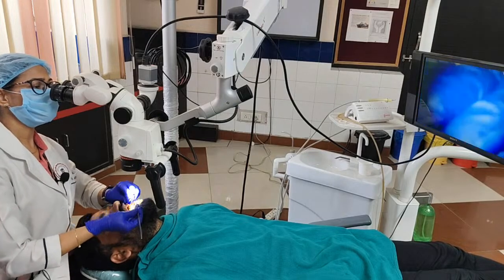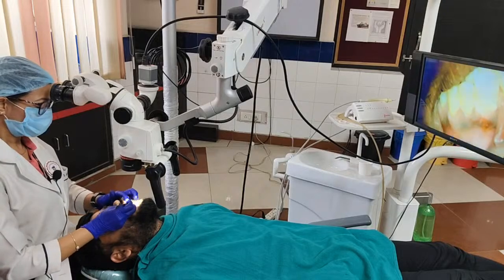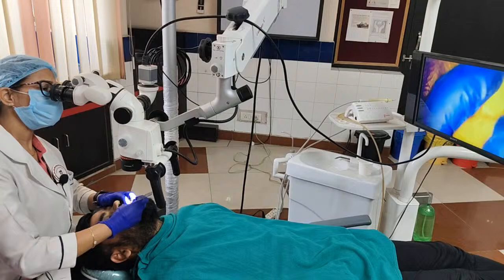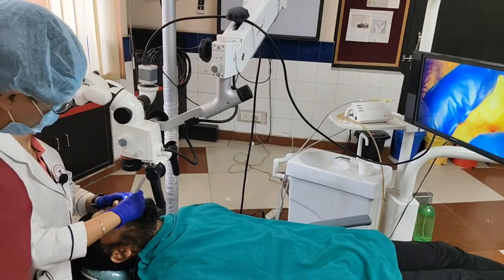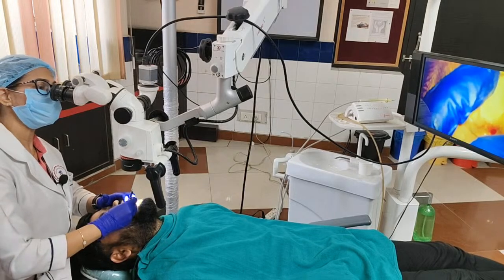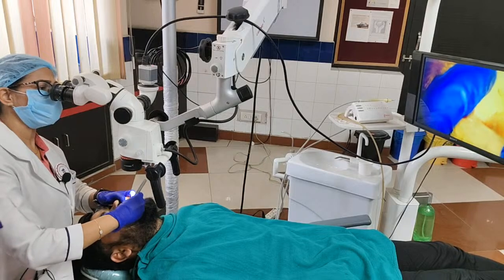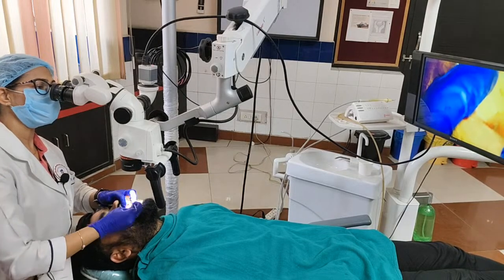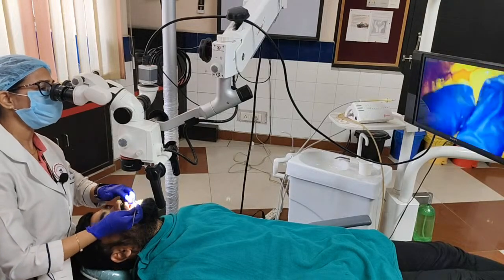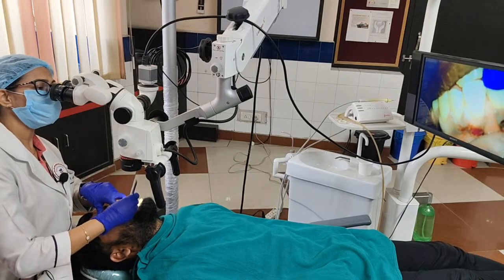Now one thing, before I started the procedure, I asked the patient to smile. And why do we ask the patient to smile? Anyone please? The amount of gingival visibility. Excellent. The amount of gingival display. We are checking for the amount of gingival display. In some patients, the patient has a very wide smile, a premolar to molar, or molar to molar smile. In this patient, it's hardly canine to canine. So, that's where your depigmentation is needed.